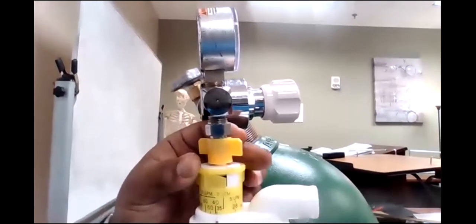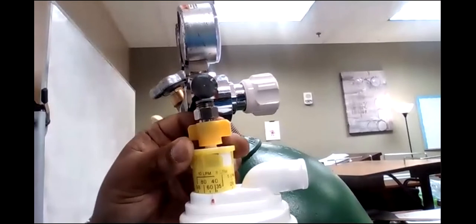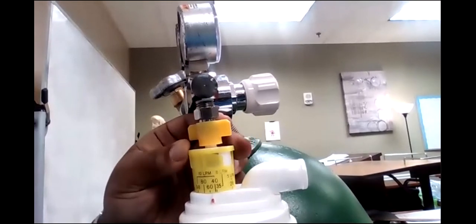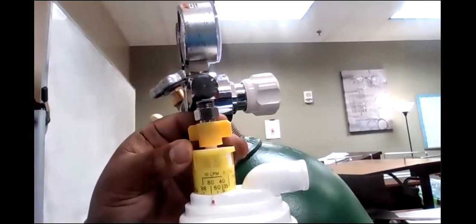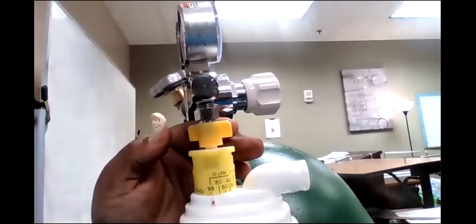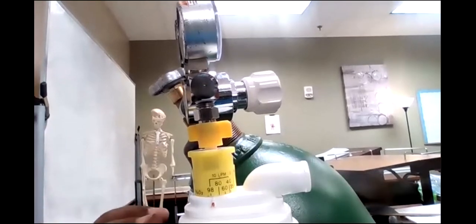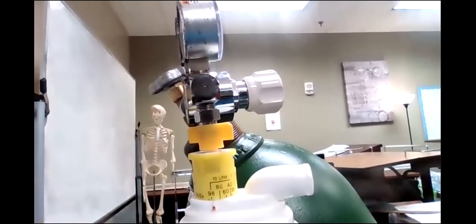So let's try 35. Just listen as it gets lower. 40. Sixty, 80, 98. See that? Now I'm getting a whole lot of FiO2, but just barely some flow.